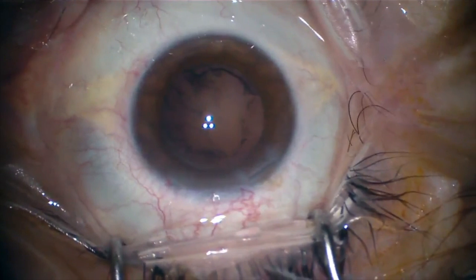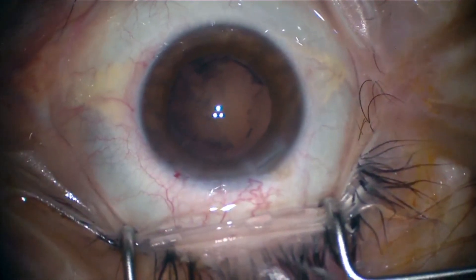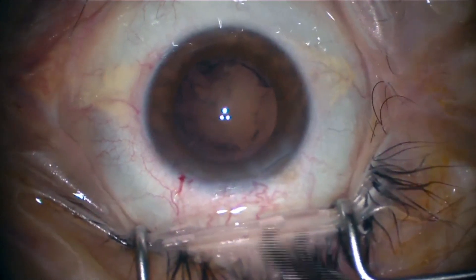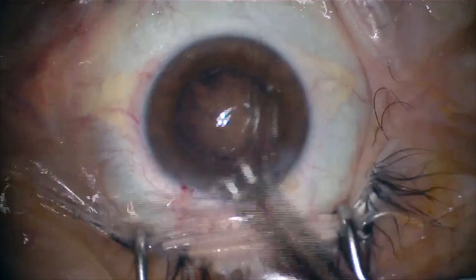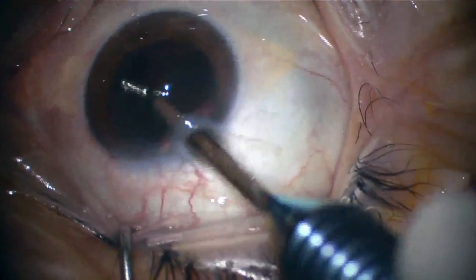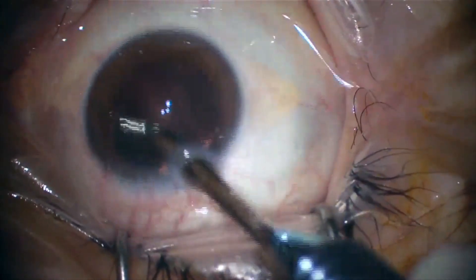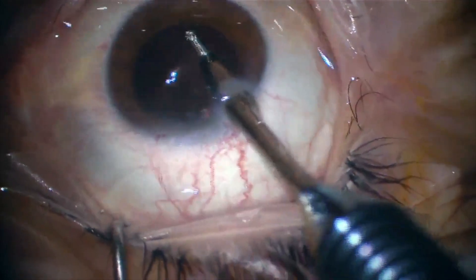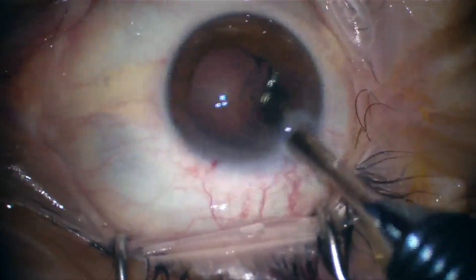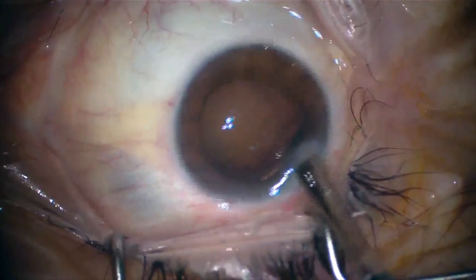We use the irrigation-aspiration piece to aspirate the remnant cortex. This piece fits tightly at the 2.2 millimeter incision, and with this aspiration piece the incision may be enlarged — that is why we have to place a nylon suture at the end of the surgery.